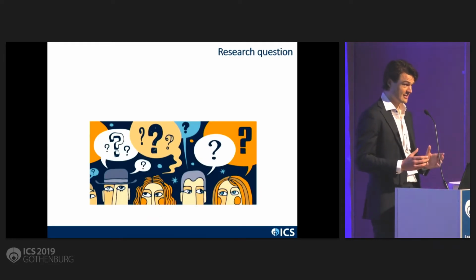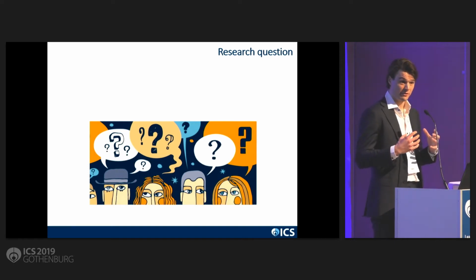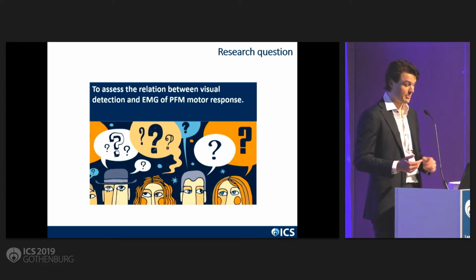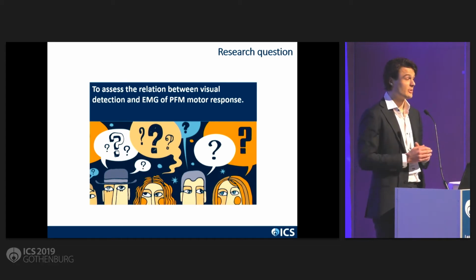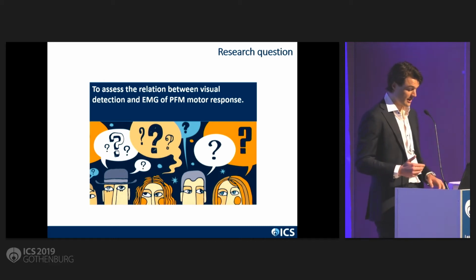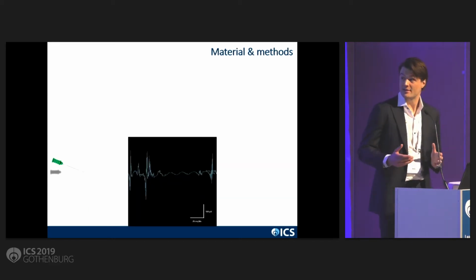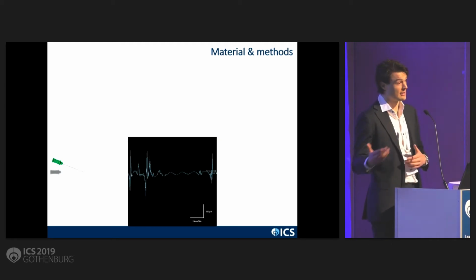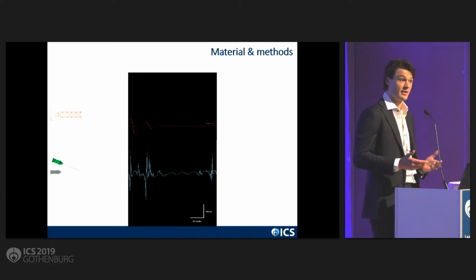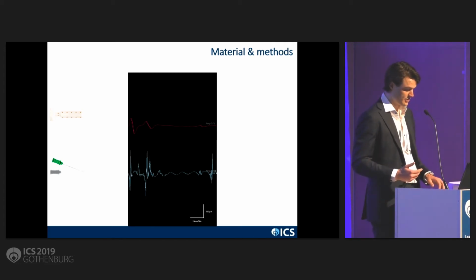Until now, it is generally considered that this inward contraction of the pelvic floor muscles is due to a reflexly mediated response by the spinal efferents, meaning an oligo or polysynaptic reflex response. This study assesses this hypothesis by examining the relation between a visual contraction of the pelvic floor musculature and when it's recorded by EMG. So we investigated this relation by performing needle EMG, similar to the studies just mentioned, as well as intravaginal surface EMG, which has the advantage of being less invasive and easier to use.